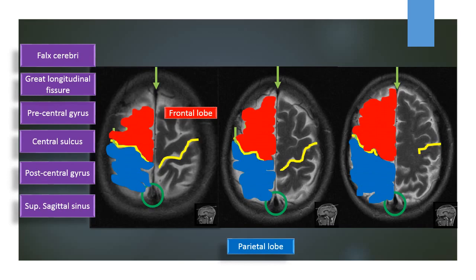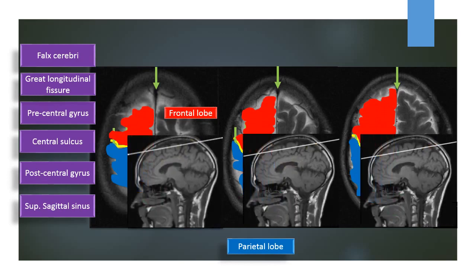In these sections, we are unable to see the occipital lobe because the sections are passing above the topographic location of the occipital lobe.